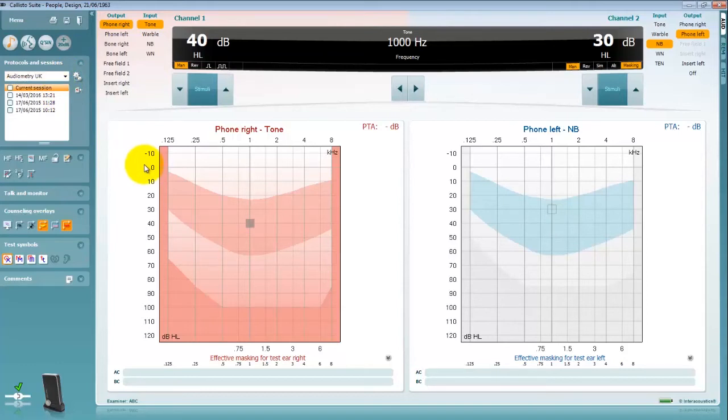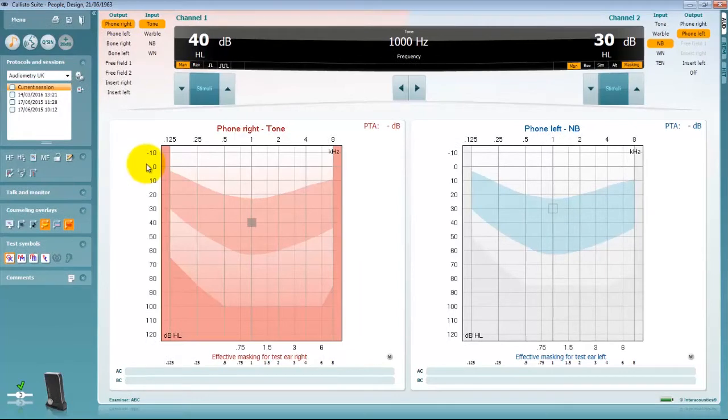Your protocol contains all the preset parameters and settings required to operate your audiometry testing.